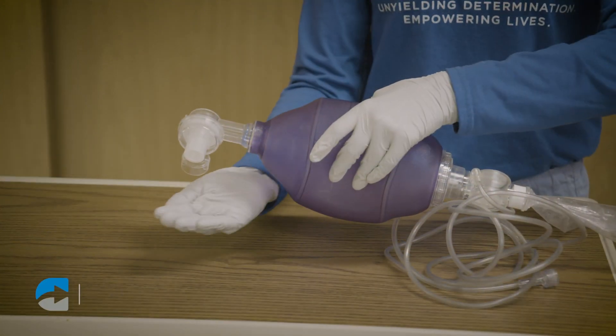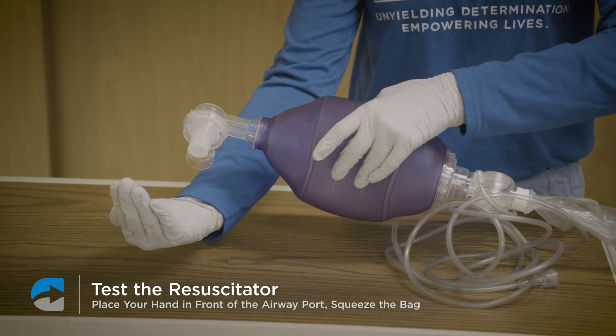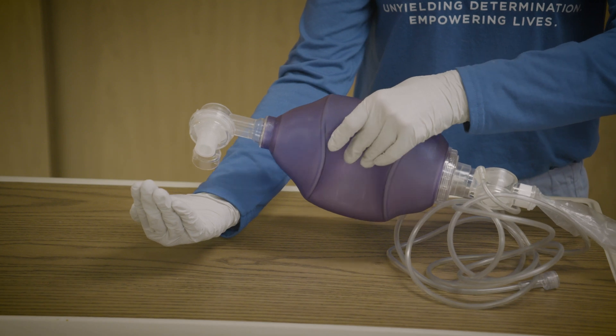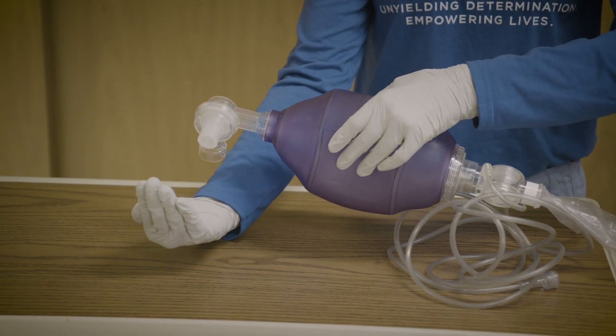Test the resuscitator before attaching it to the person. To do this, place one hand on the front of the airway port, squeeze the airbag, and make sure air is coming out of the port.